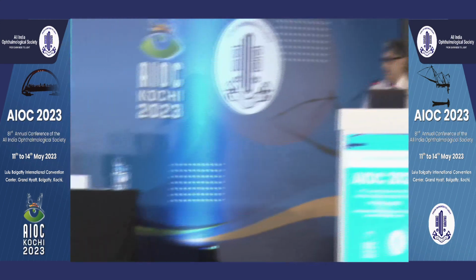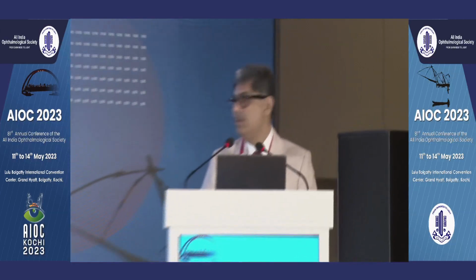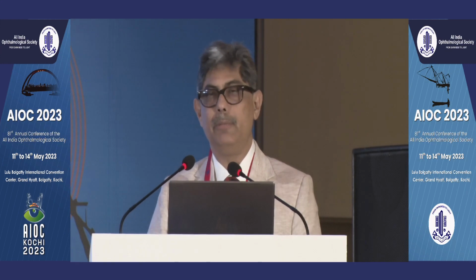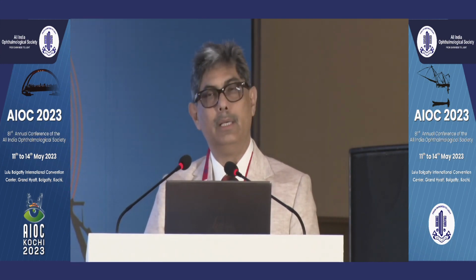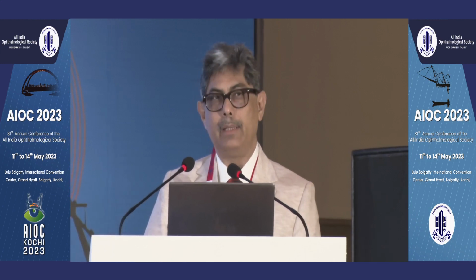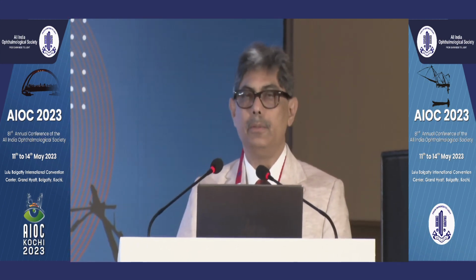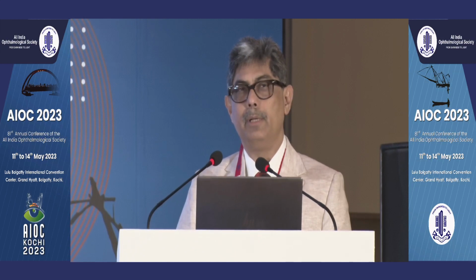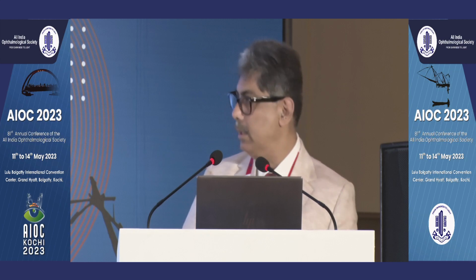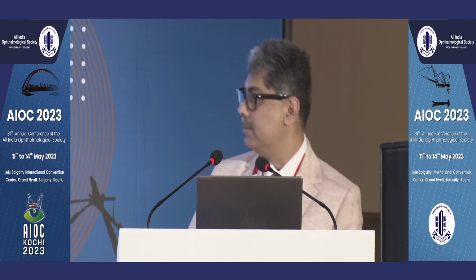Yeah, definitely. Sir, the company says that it is 2.8 millimeter, but in a personal way, I have done it in 2.7 millimeter also, and really the development of cataract and the vault is not an issue. Even with 2.7 millimeter, we can go ahead and do this, the phakic lens, in my personal experience.